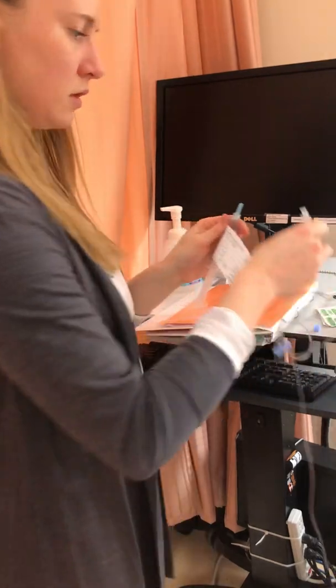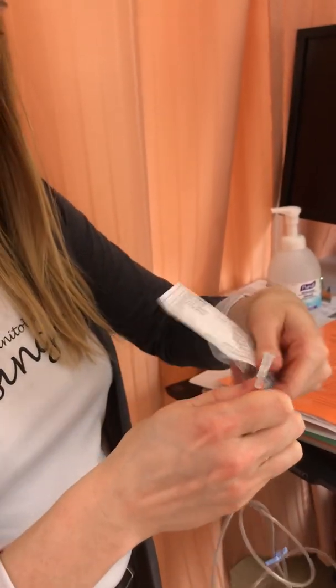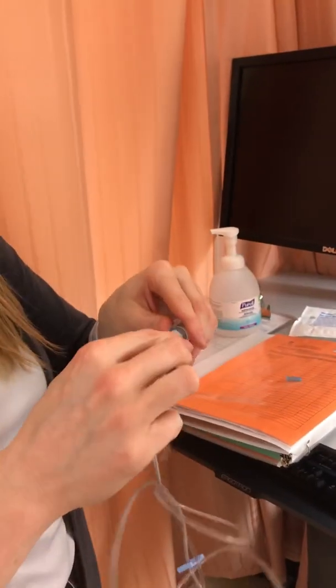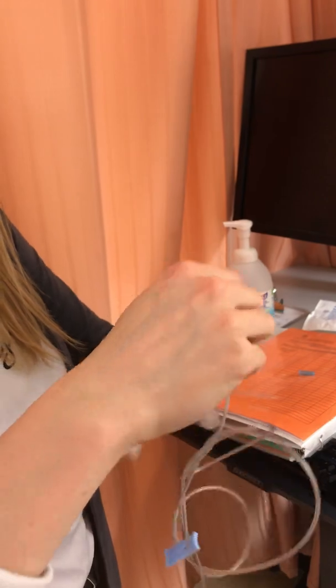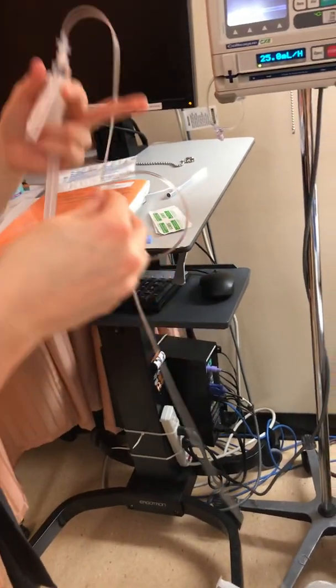So my med label here, I'm going to do my check before I put it into my saline here. So this is furosemide. This is furosemide, and this is furosemide. Good. So I am moving down the tube. And we're going to be putting this as an IV.